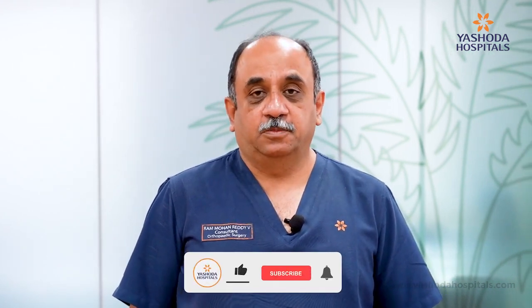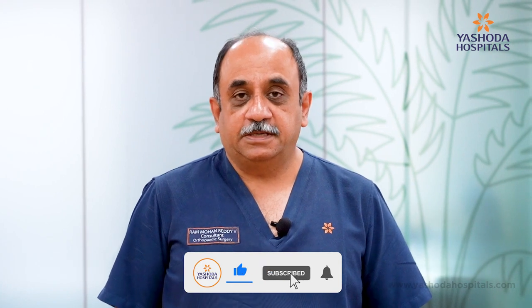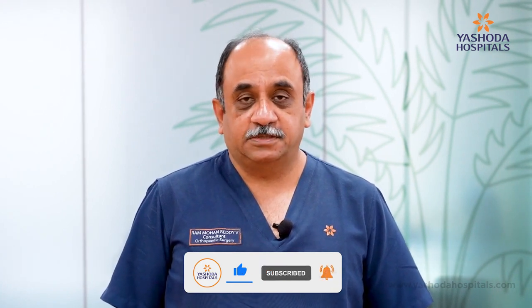Let me explain to you how the robotics works. In knee replacements, there are different types of robotic systems which have been installed or invented by the companies. Now, each company has got a unique robotic system. With the robotic system, the surgeon has to use the implants only manufactured by that company, which means the robotic system is implant specific. If a surgeon uses a robotic system of say A company, he cannot use the implants used by another company.